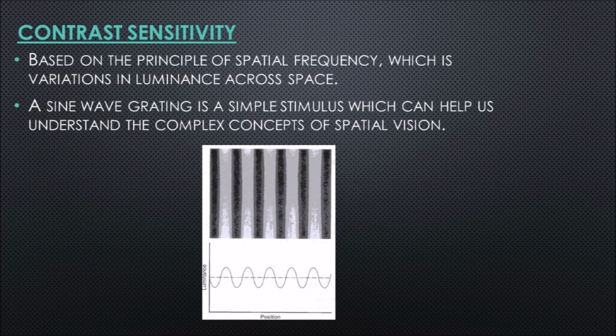Contrast sensitivity is based on the principle of spatial frequency, which is variations in luminance across space. A sine wave grating is a simple stimulus which can help us understand the complex concepts of spatial vision. The sine wave grating and its luminance profile is shown here.